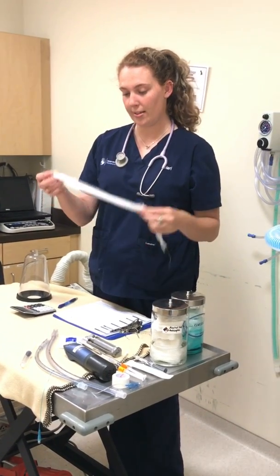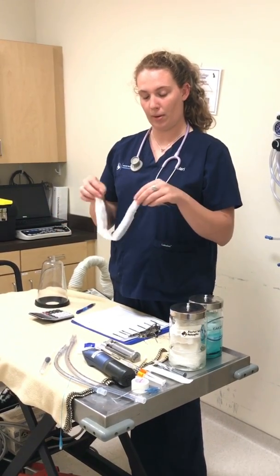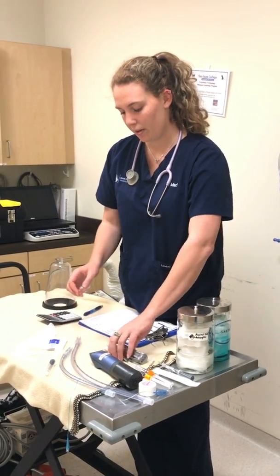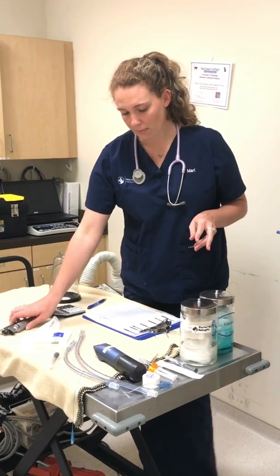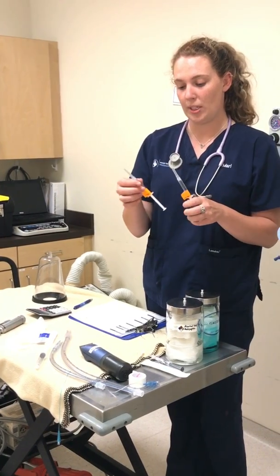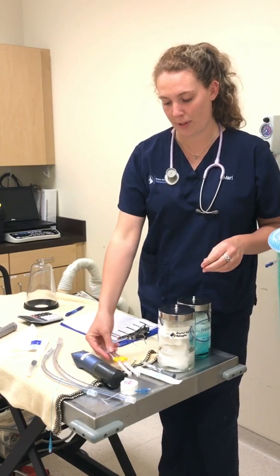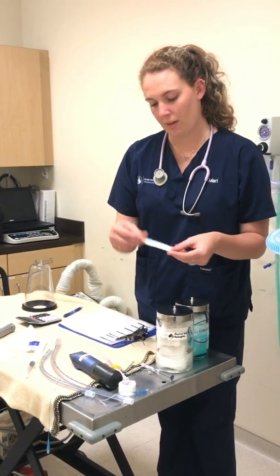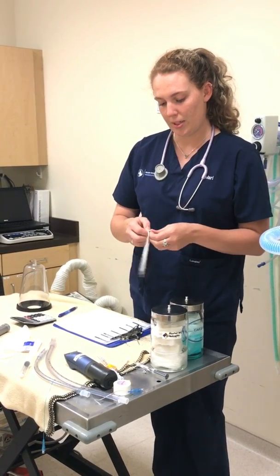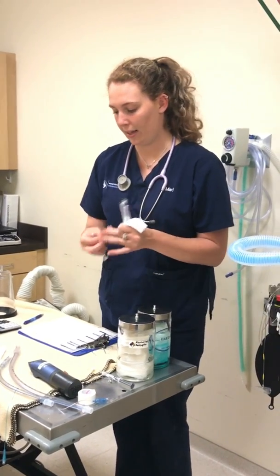I'm going to just lay my cuff syringe next to those so that it's close by for inflating the cuff after they're placed. I've got my tie that is of adequate length to go around the ET tube as well as up around Kinsey's muzzle. I've got some sterile lube to lubricate the end of the tube and my laryngoscope. I've got my heparinized saline flush, which is at a concentration of 5 units of heparin per 1 ml of 0.9% saline. Got an 18 gauge catheter, which is the appropriate size for a dog Kinsey's size.